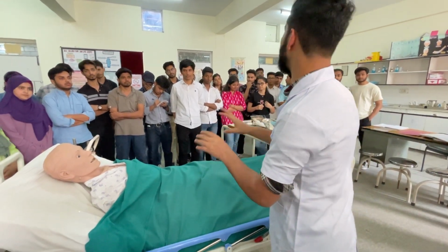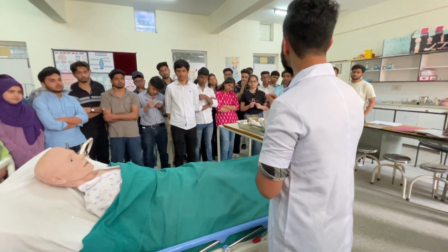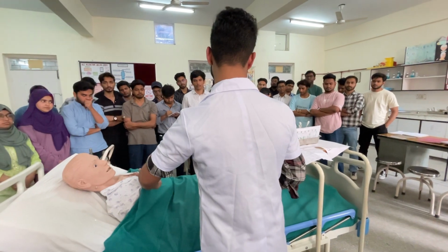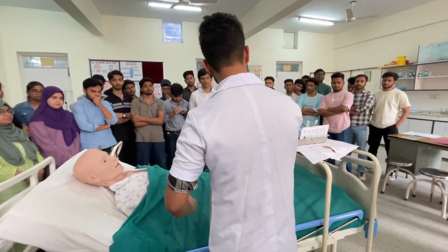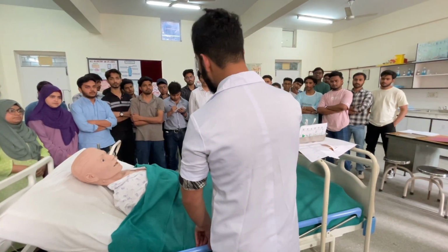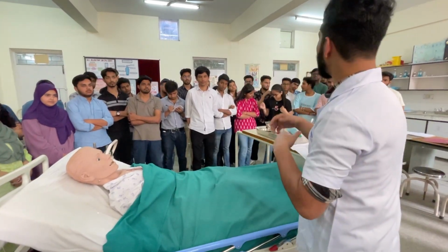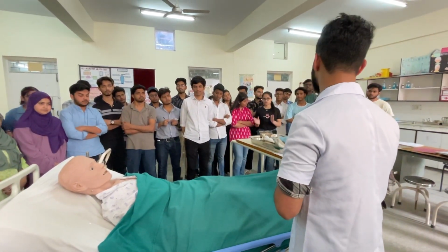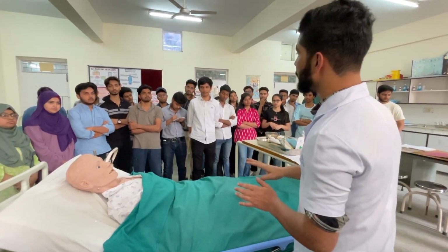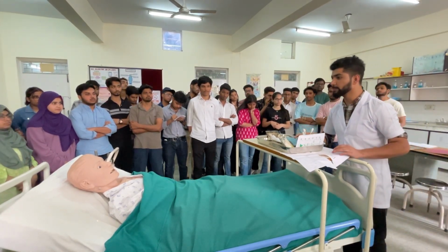Provide a comfortable position to the patient. This is also important. In this procedure, we provide semi-Fowler's or Fowler's position. This one is semi-Fowler's position, where the angle should be 45 degrees. In Fowler's position, the angle should be 90 degrees. Then explain the procedure to the patient. After that, wash your hands and then put on gloves. Now we are going to follow the procedure.